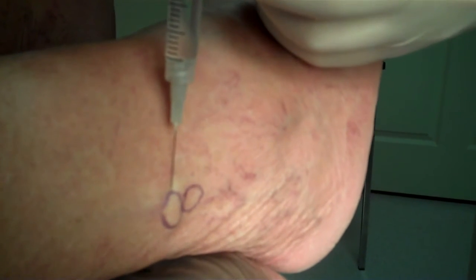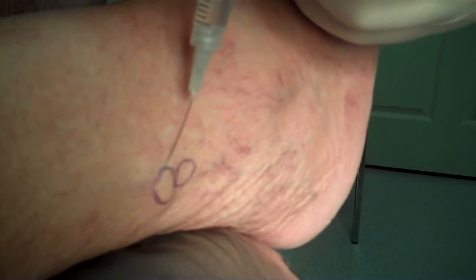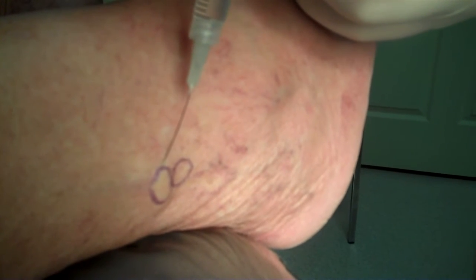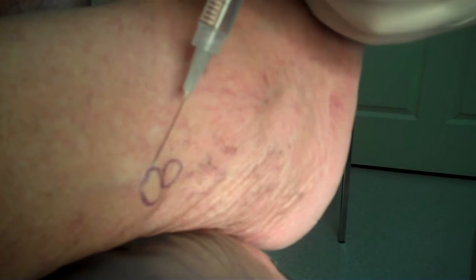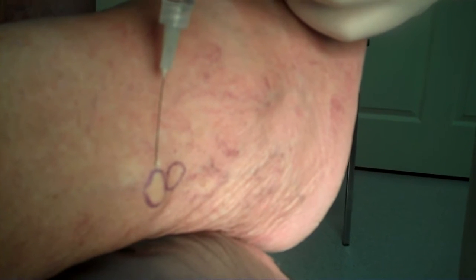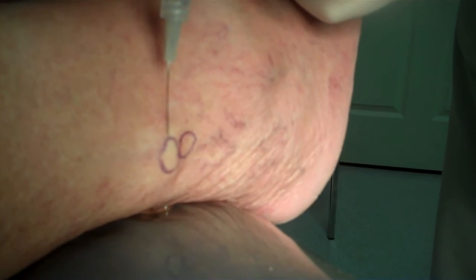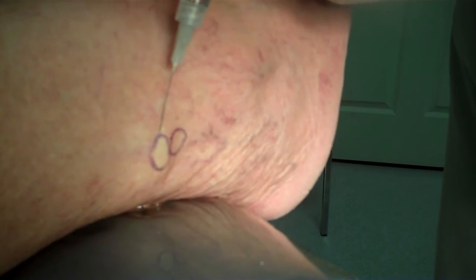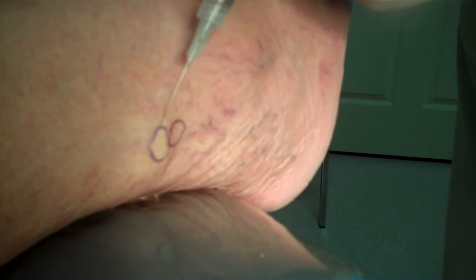All we're going to do is raise a wheal — that's just a little kind of a blistered-looking area of the skin. I'm using more anesthesia than we really need; one cc is usually enough, but I'm going to use about one and a half. There should be more than enough to do it.